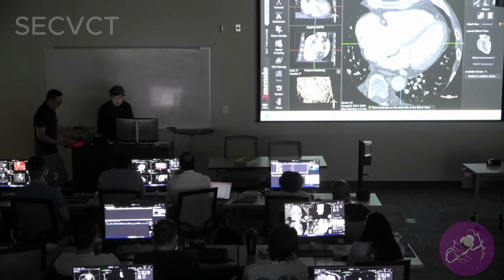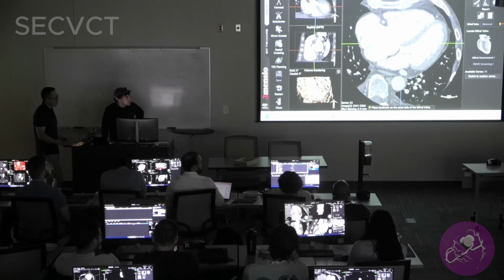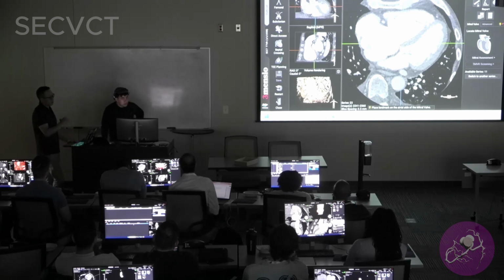Mike asked me to show you guys a couple of cases in the tricuspid world as well as in the mitral TMVR world. I know you guys were just working on TAVRs before I walked in here, and for the vast majority of places that you're going to work, knowing obviously coronary CT, but then knowing TAVRs and understanding TAVRs will probably cover 90% of what you guys may do in clinical practice.